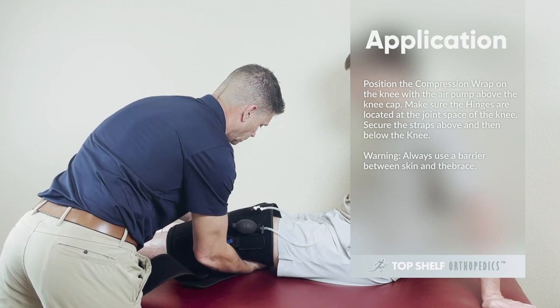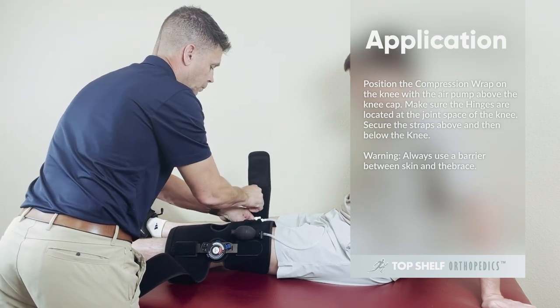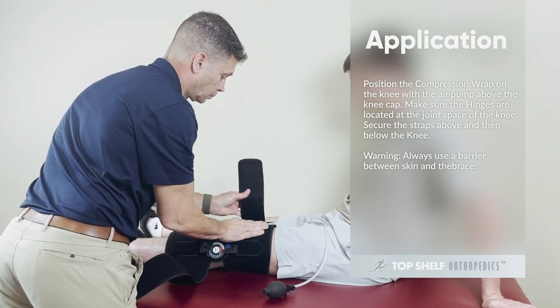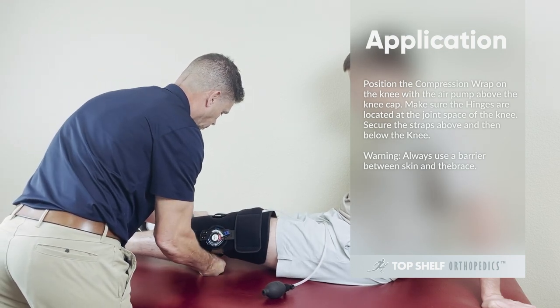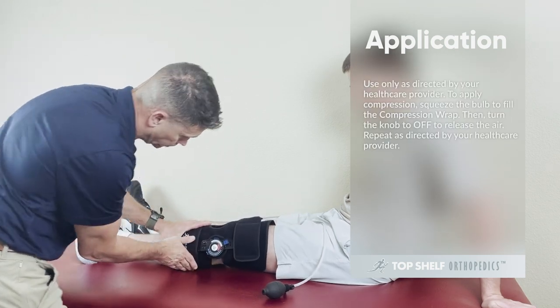WARNING! Always use a barrier between the skin and the brace. Use only as directed by your healthcare provider.